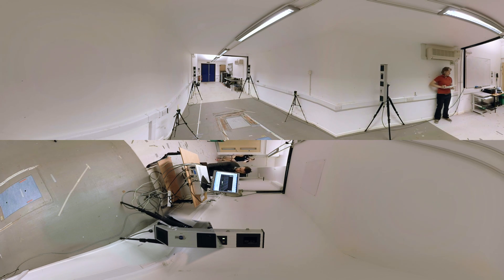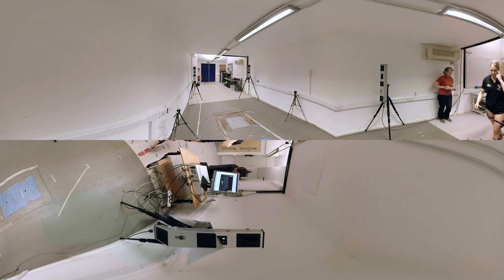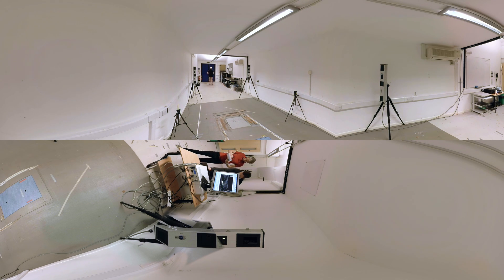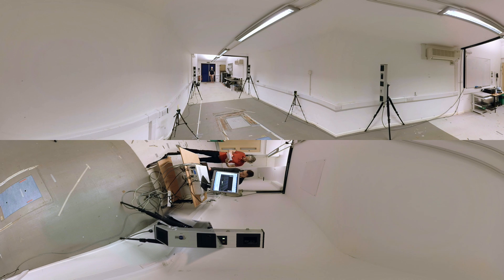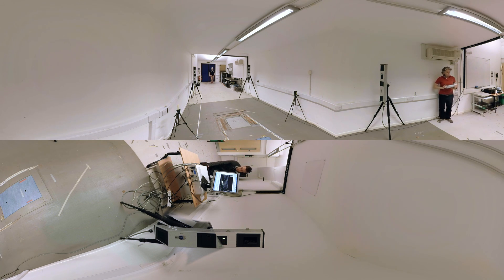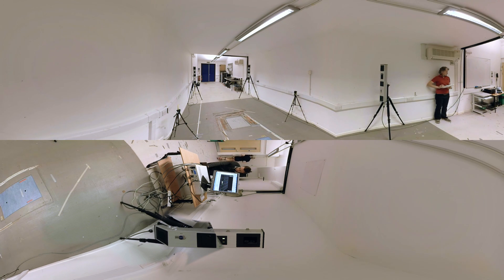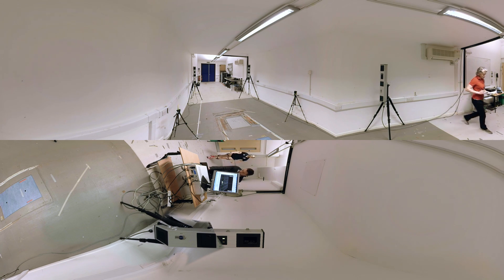Timing gates alongside the runway monitor the running speed. With this information, we can consider applications for athletic performance, understand lower limb injuries, and characterise impaired gait in clinical populations. Within each of these areas, the ultimate aim is to identify interventions which can improve outcomes for these populations.